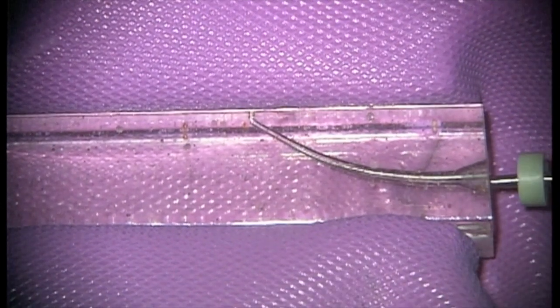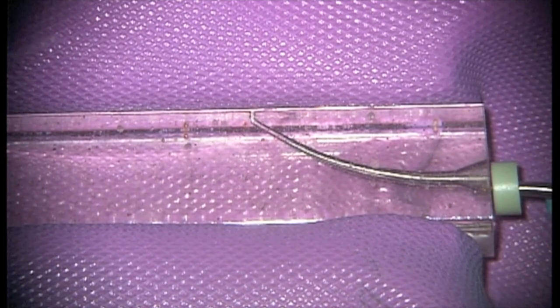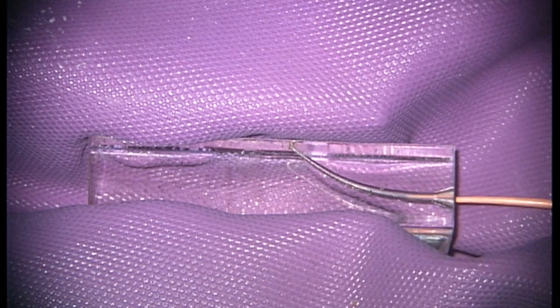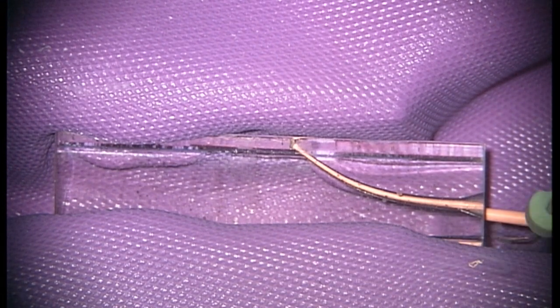The tip fits adequately into the space to 3 to 4 mm from the terminus. We can adjust our rubber stop to determine precisely where that point is, which will serve as a reference during the down pack phase. The soft steel of the System B plugger tip enables us to adapt to really any curvature within the natural human anatomy.